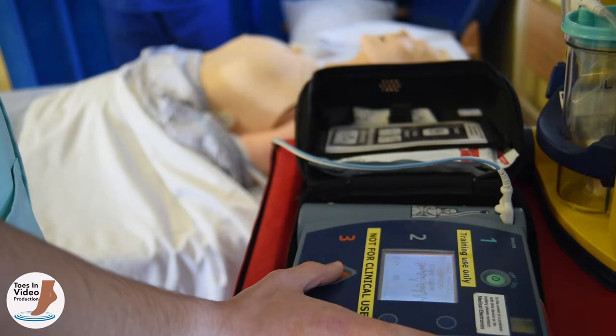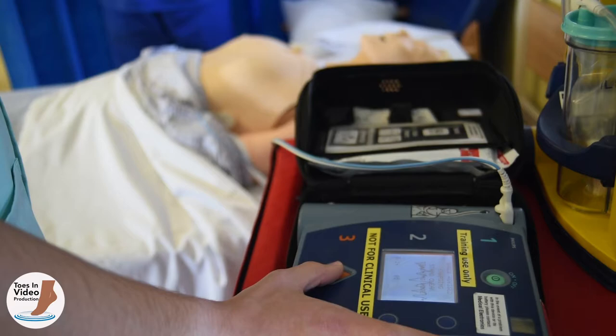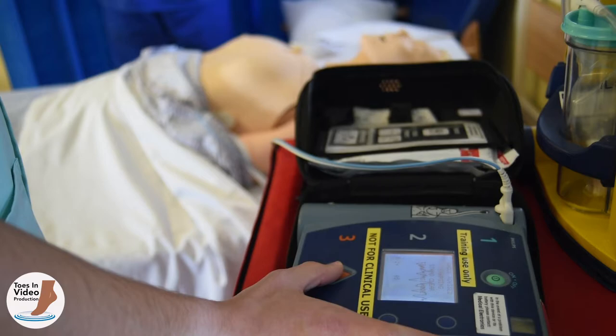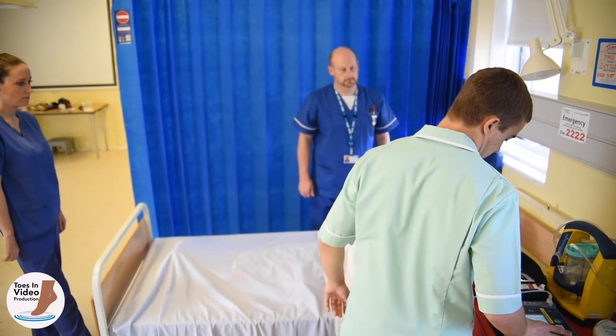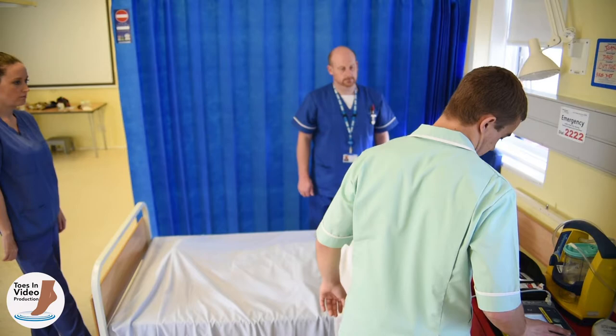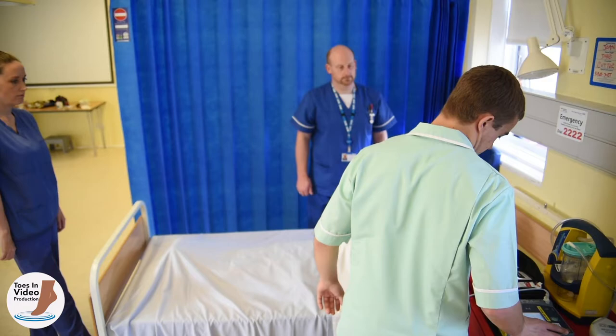The person operating the defibrillator, regardless of their profession, grade or experience, is responsible for the safe use of the device. Ensure no one is in contact with the patient by conducting a 360-degree check of the space around the patient and clearly verbally indicate that you will be shocking the patient. When the defibrillator has charged, it will indicate that it is now ready to discharge the shock. When it is safe to do so, having checked no other rescuers are in contact with the patient, clearly announce that you are shocking the patient and press the button to discharge the shock.